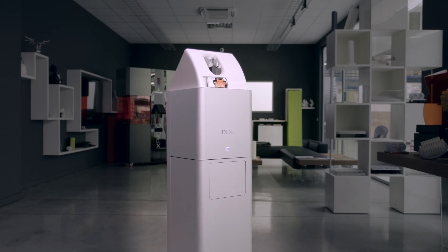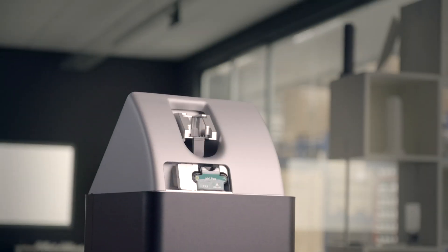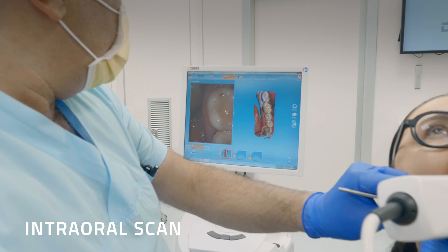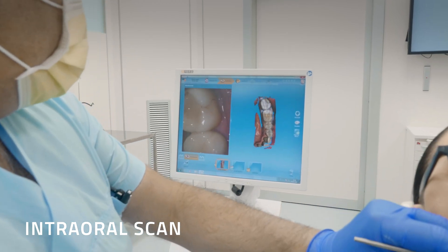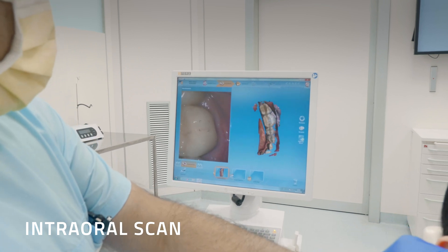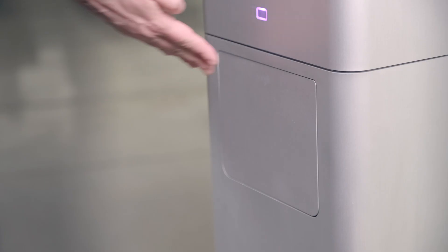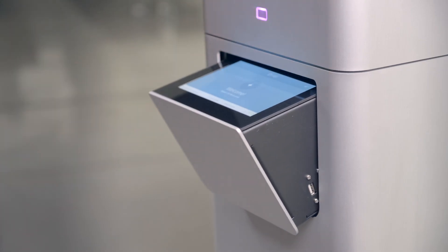With DFAB, all the steps of the workflow are simple and intuitive. Everything starts with an intraoral scan, which can be done with the most common scanners available on the market. The STL file obtained is appropriately modeled using CAD or CAM software, after which it is ready for printing.